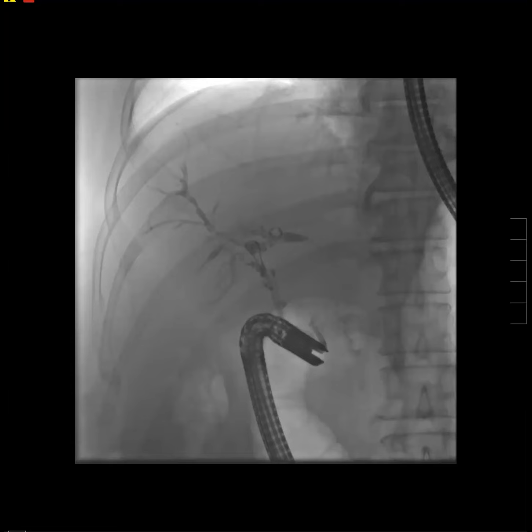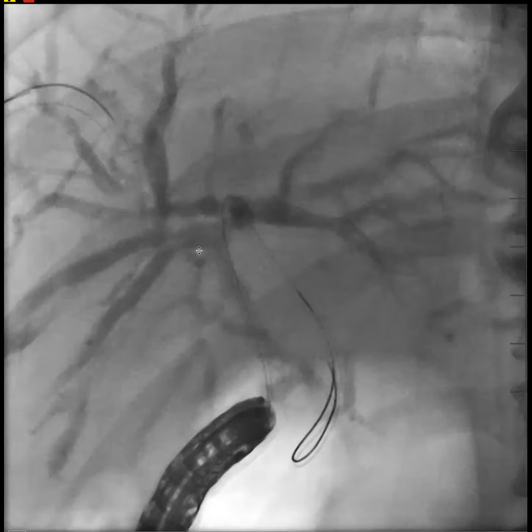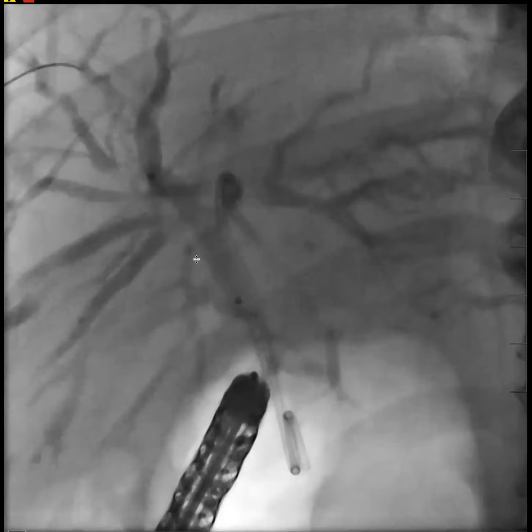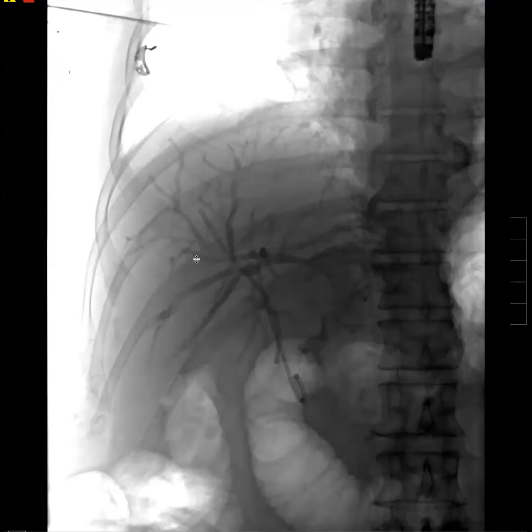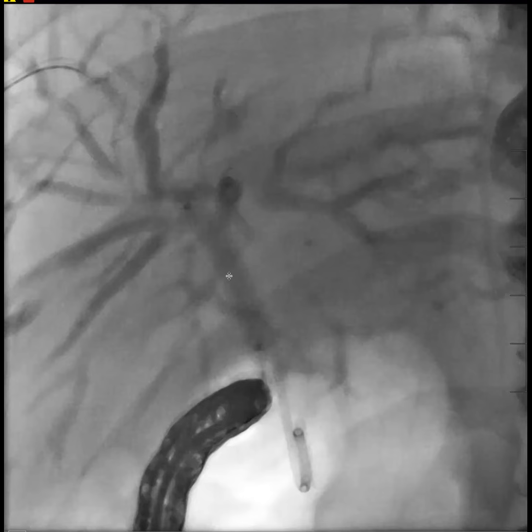The patient's hepatic artery is totally normal; it's patent. After a year out after transplant, it's gotten better. The LFTs have normalized or stabilized after an acute exacerbation.